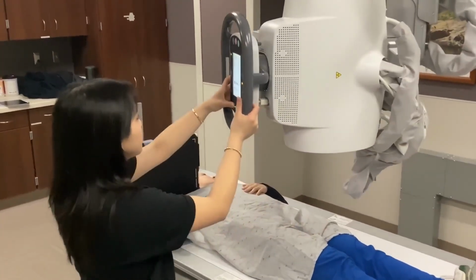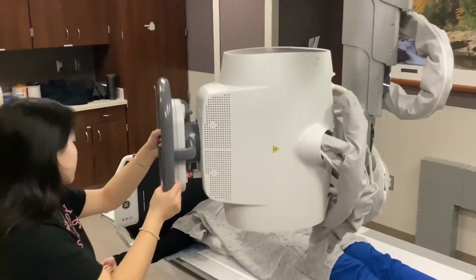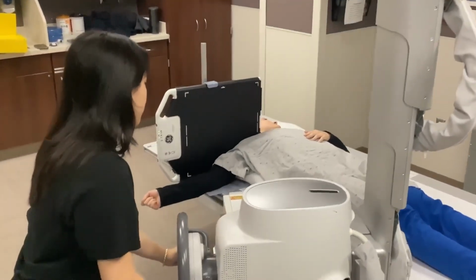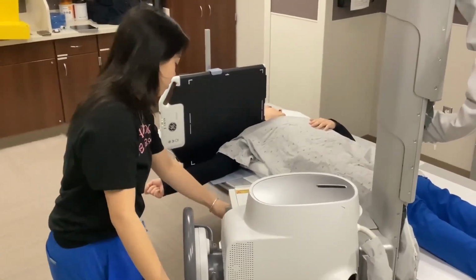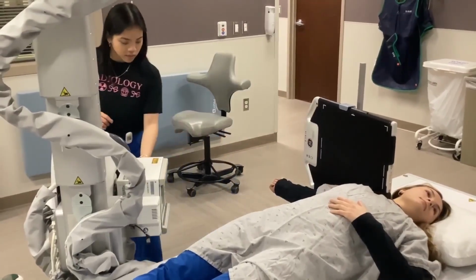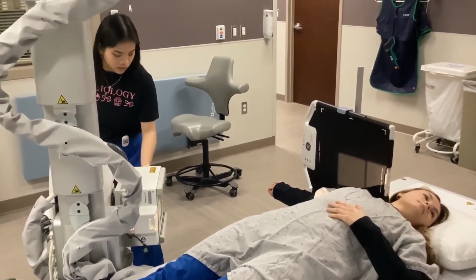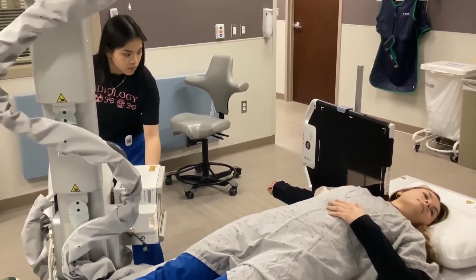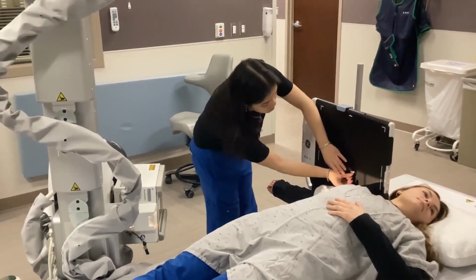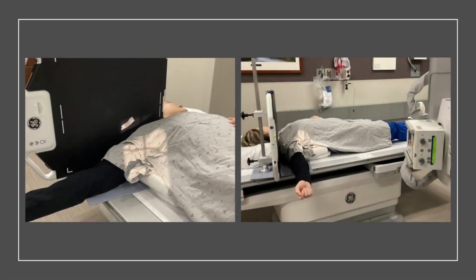The central ray is placed perpendicular to the IR, and a 15 to 30 degree medial angle is placed on the CR. We're going to direct the CR through the axilla towards the AC joint. The shoulder joint is placed parallel to the IR, which is placed superior to the shoulder. We'll then mark the affected side and collimate tightly to the shoulder joint.